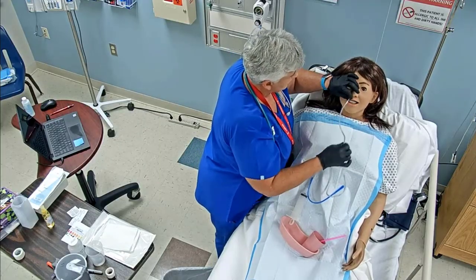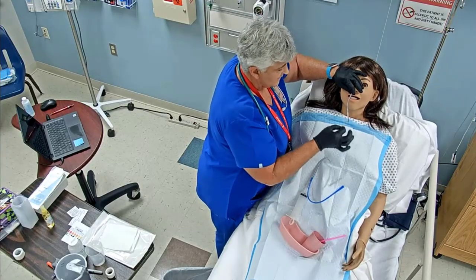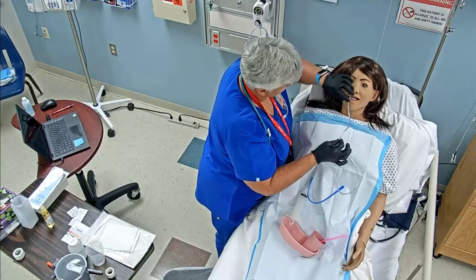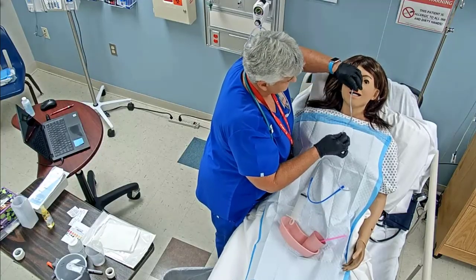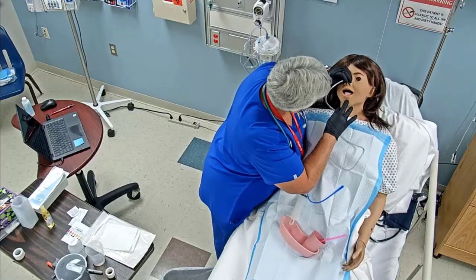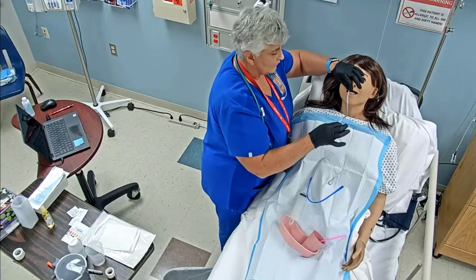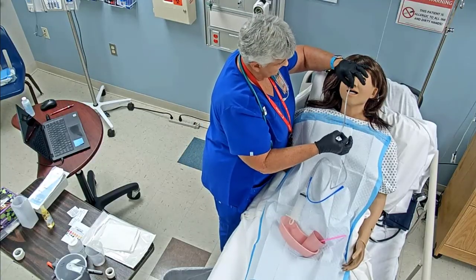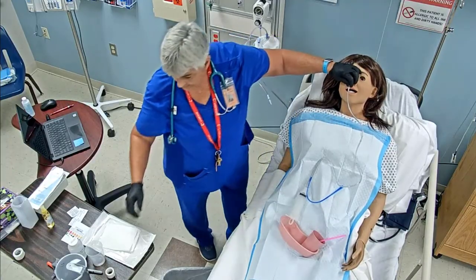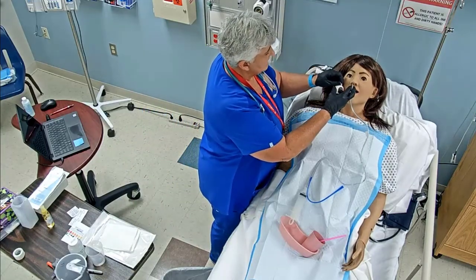Our marker is going to be right here, and with this mannequin, we couldn't get it to go all the way in. I need to make sure she's not... You don't ever want to put your hand in their mouth because they can bite you. This is all the way up to here, and I should have done this prior to, so I need to make sure I hold that.